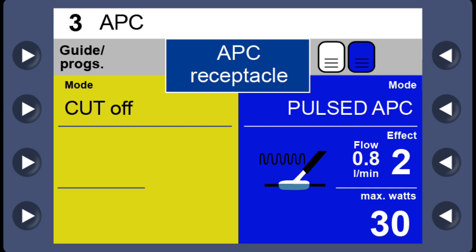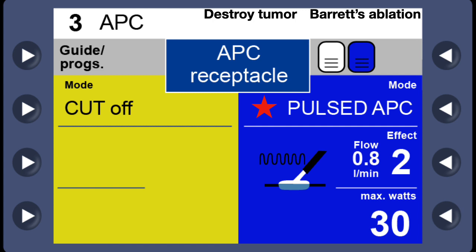Next is Pulsed APC, where the gas comes out of the catheter in pulses. If you select Effect 2, you get more frequent pulses; if you select Effect 1, you get infrequent pulses. Pulsed APC is used to destroy tumors — pressing the blue pedal delivers APC in a buzz-buzz pattern, helping ablate large areas such as in Barrett's ablation. It is also useful for treating large areas of bleeding, for example, gastric antral vascular ectasia.